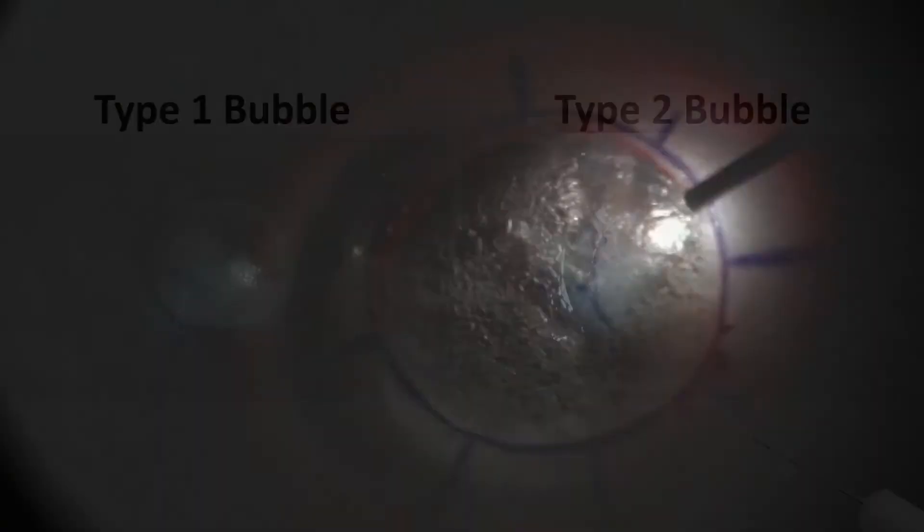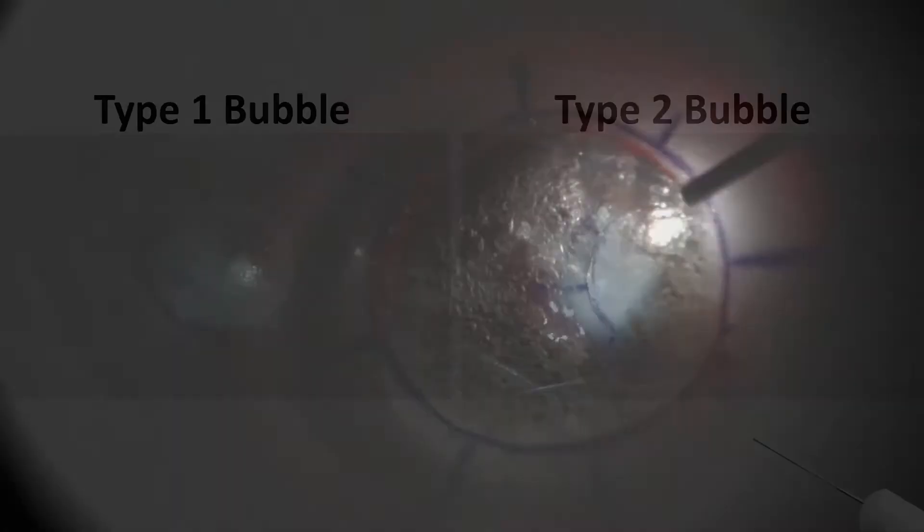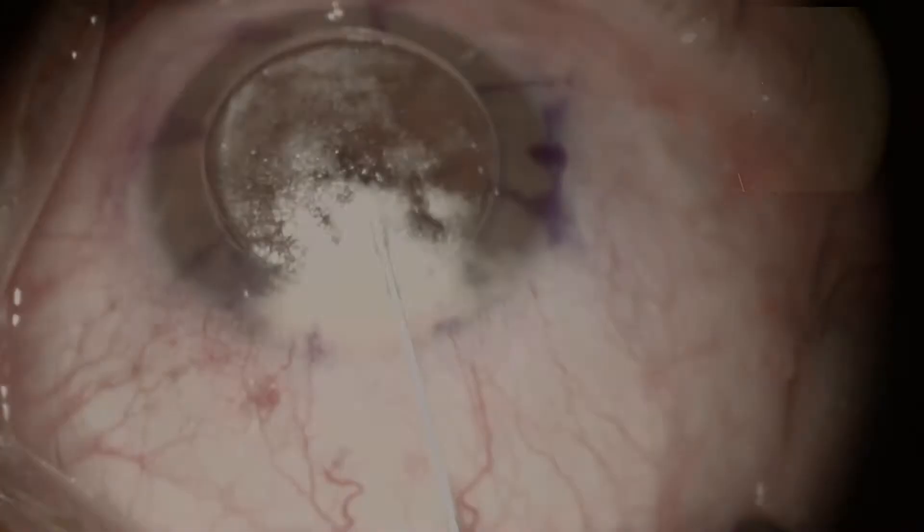Here is a comparison of type 1 and type 2 bubbles. This other case shows how a type 2 bubble looks under corneal transillumination. We call this sign 'waning moon.'